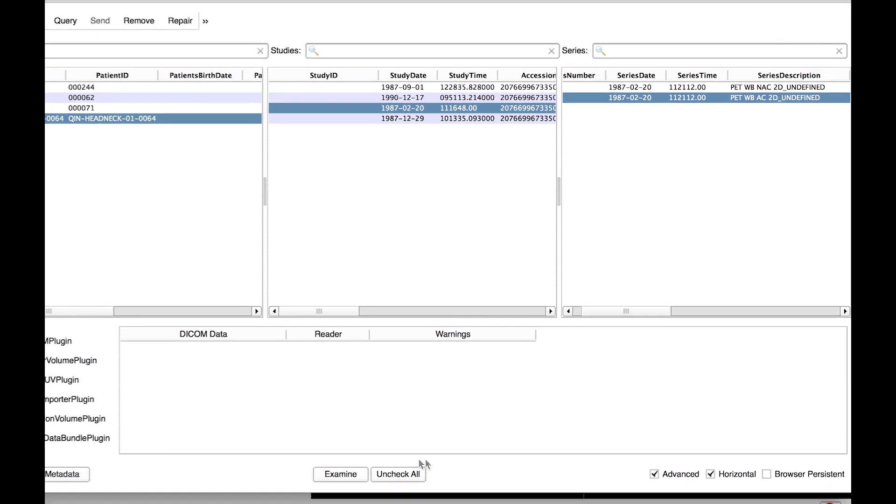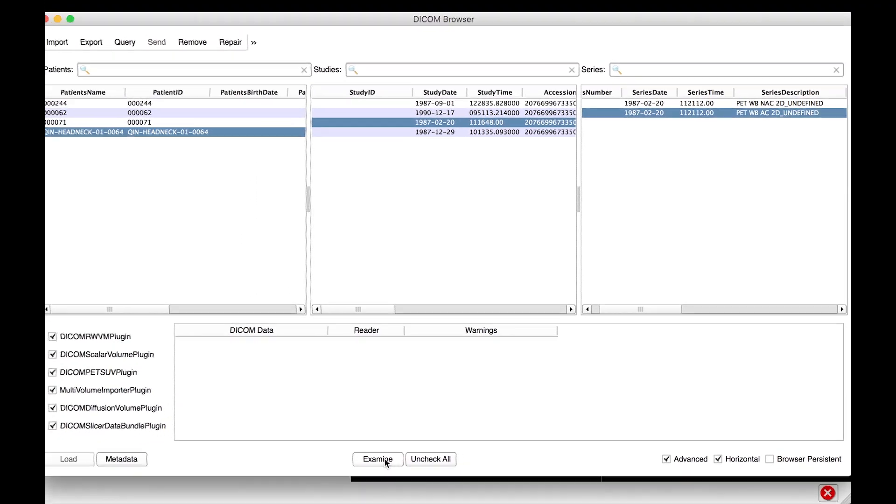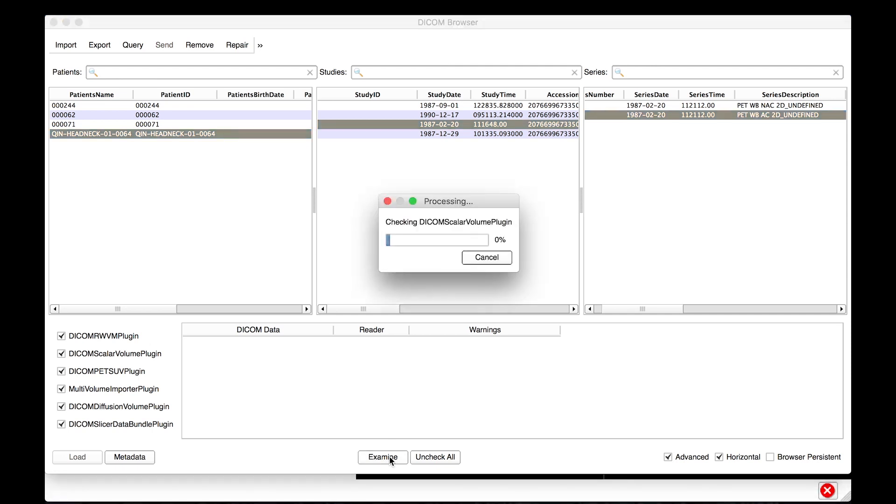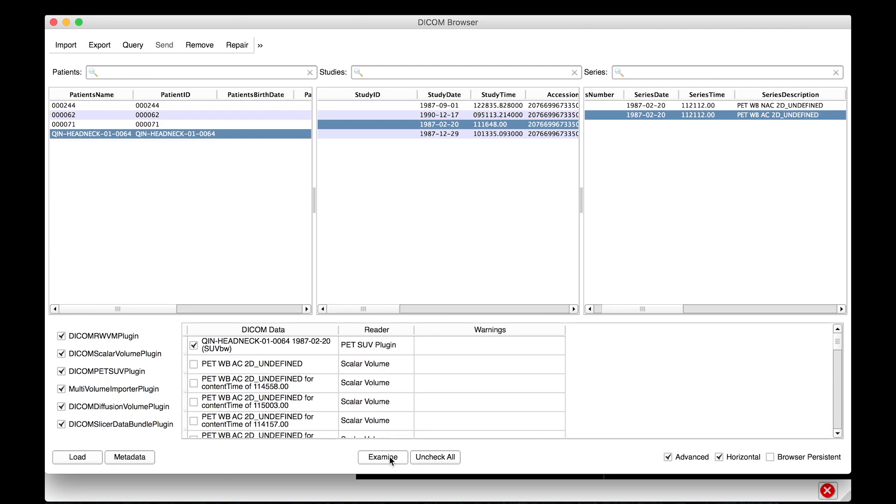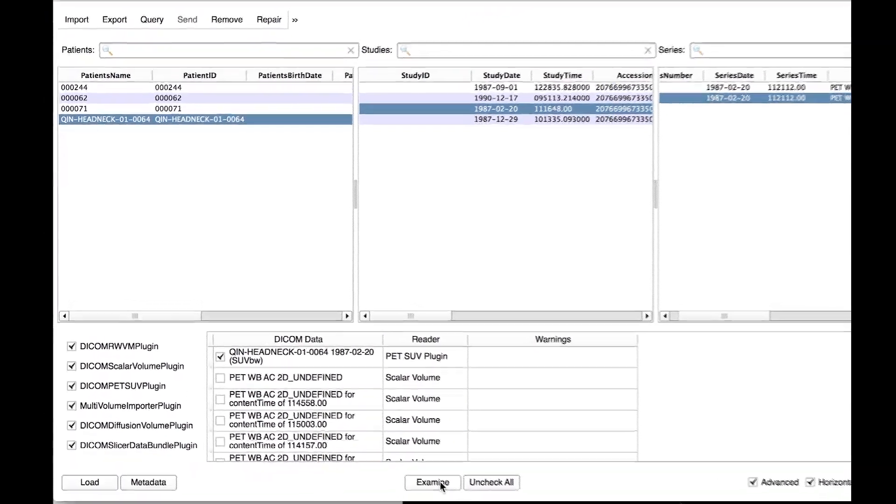Then, click Examine to analyze import options. The PET-SUV plugin is part of the PET-DICOM extension, and it will offer the option to load the PET scans as a SUV normalized dataset.